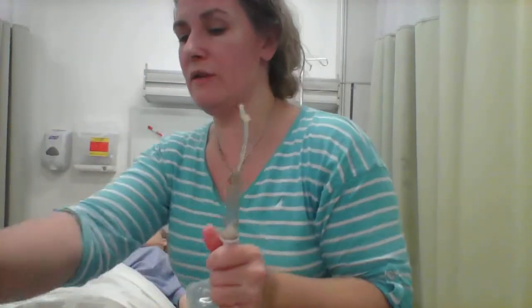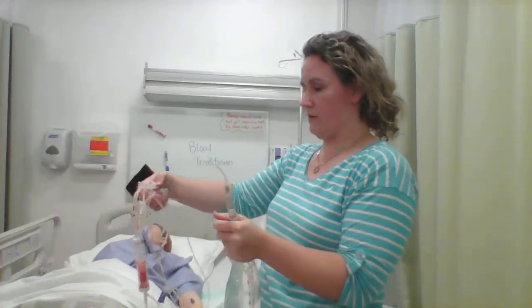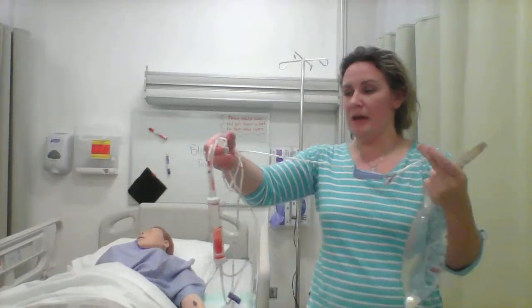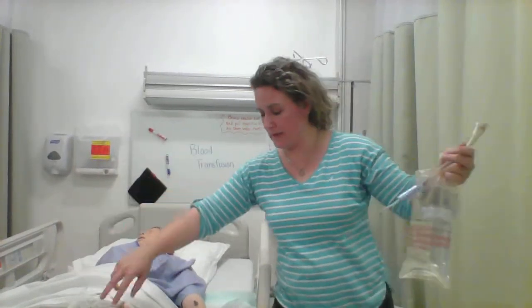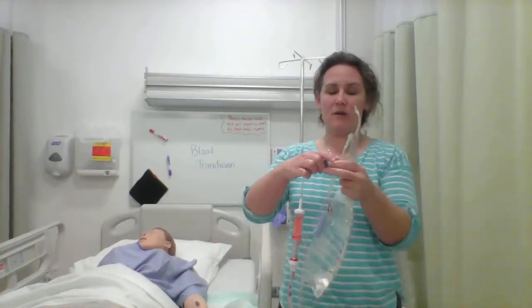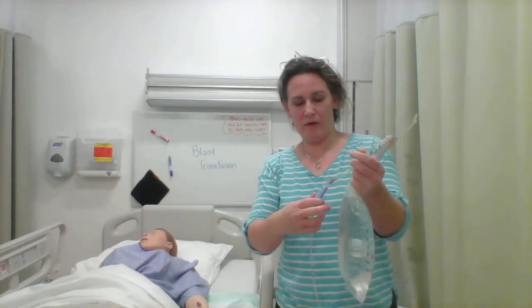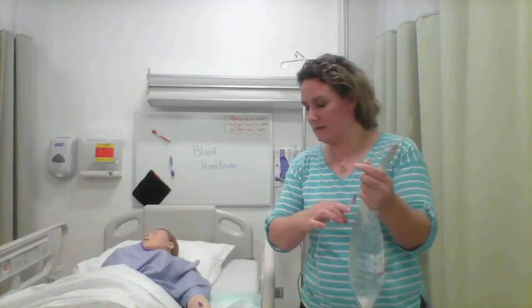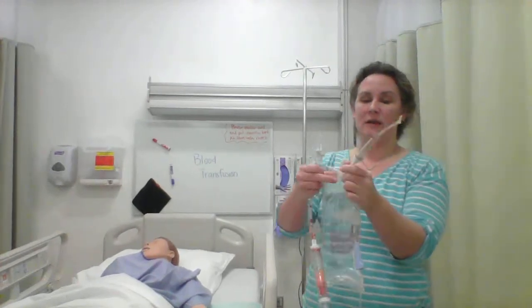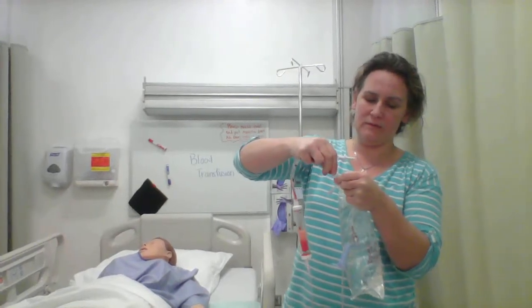So I'm going to go ahead and get this bag prepped and ready for him. I would open this tubing out of a sterile package, and then I'm going to confirm that the tubing is intact and that the clamps are on and it's tight before I spike it and flip it. So the tubing is intact, and I'm going to go ahead and spike it now.